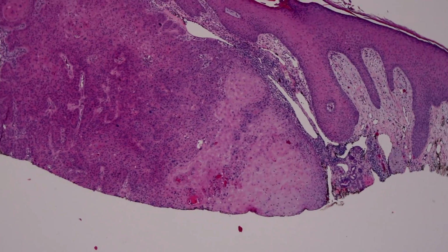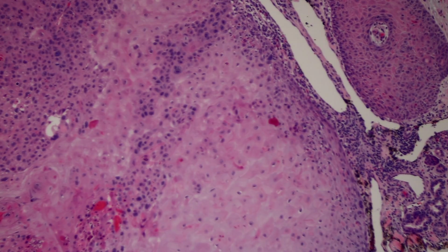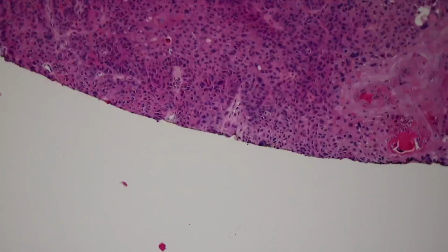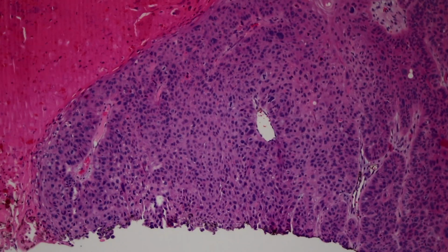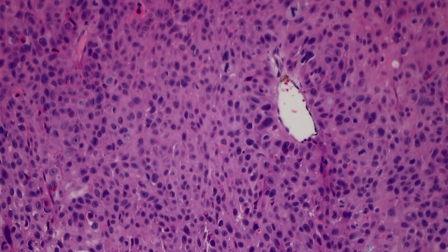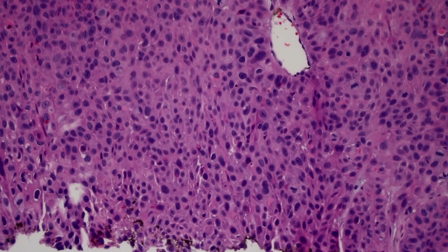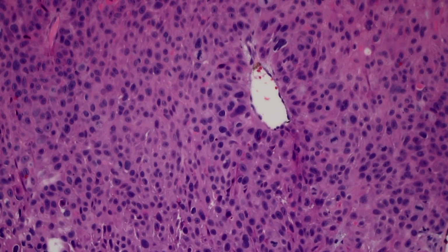So over here, nice glassy, obvious squamous cell carcinoma. That I would say represents well differentiated, right? When you see squamous cell carcinoma and you know obviously that's squam, well then that's well differentiated. When you start seeing kind of sheet-like areas where the tumor gets a little more ugly, like say right here, probably that's fine with squam, but if you just had that, you could start thinking, gosh, it's very sheet-like. Is there any chance this could be something else like melanocytic? Probably not, because it's still making pink cytoplasm because of the keratin.